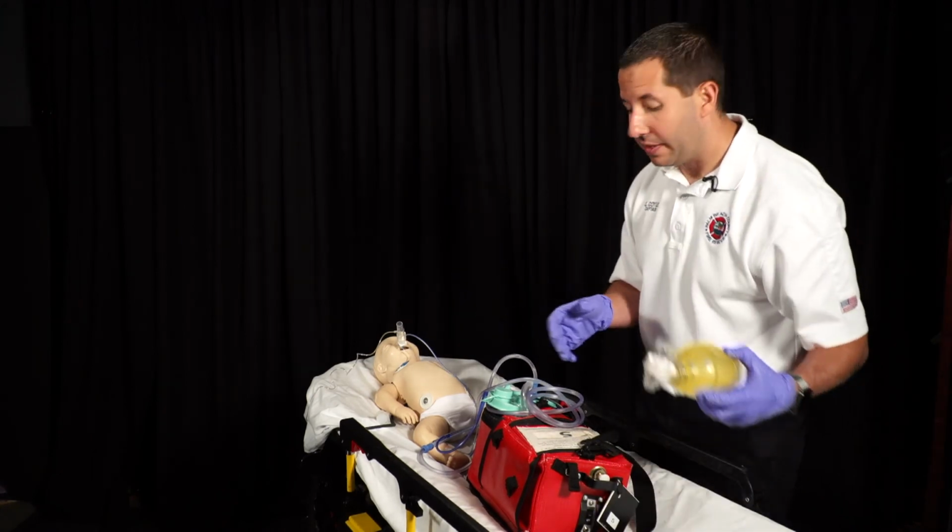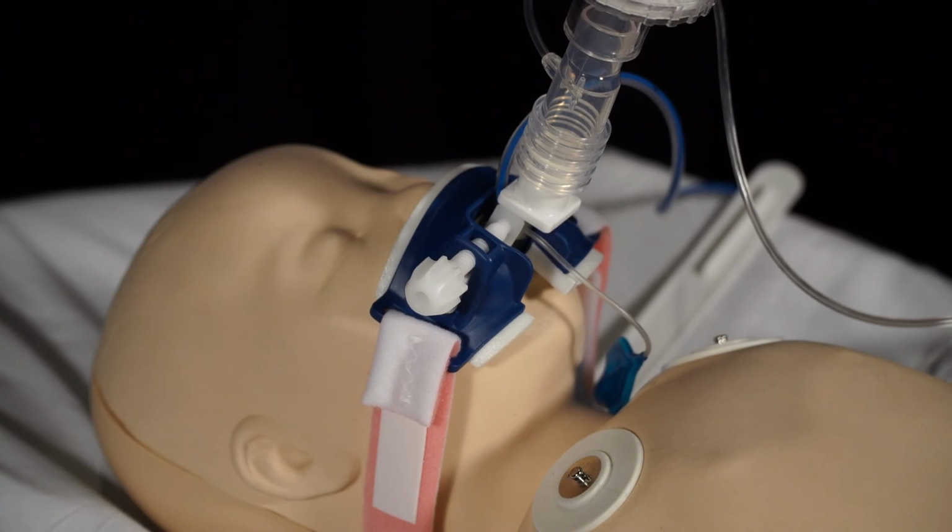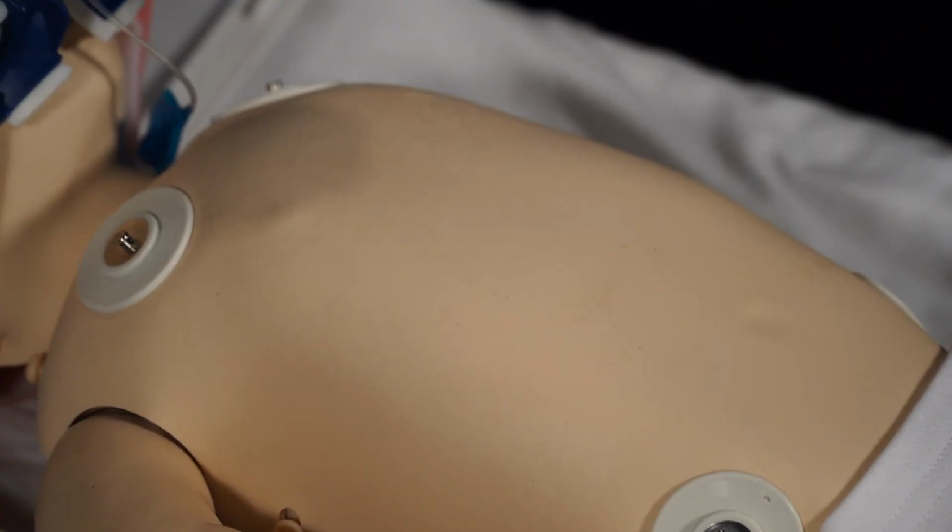Again, we will be ventilating the child 1 breath every 6 seconds. And we will make sure that we have our device secured somehow, watching for adequate chest rise and fall.